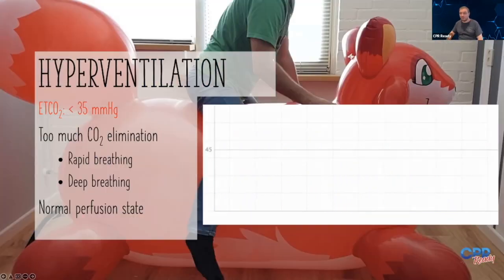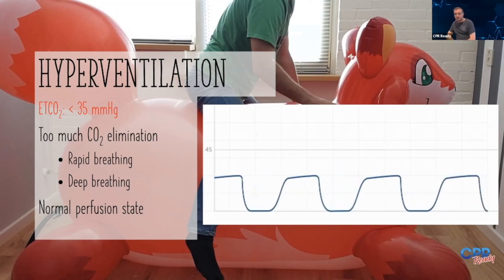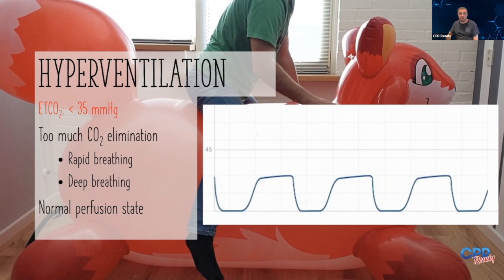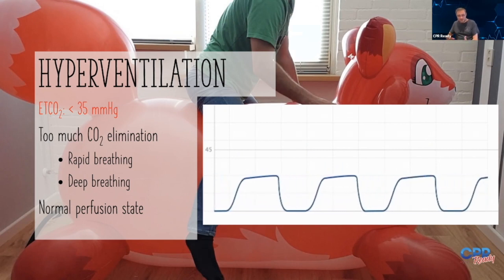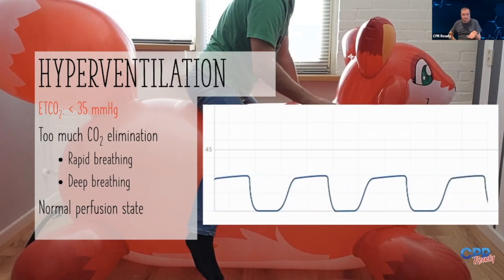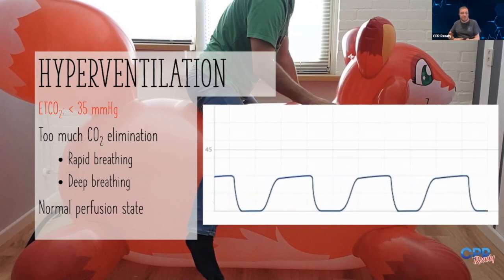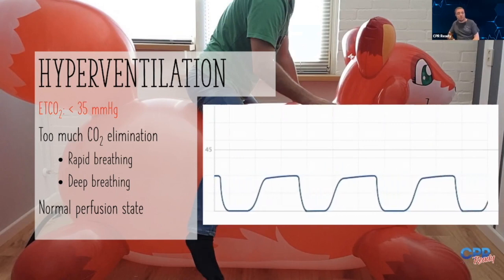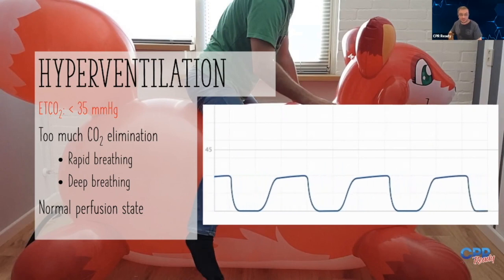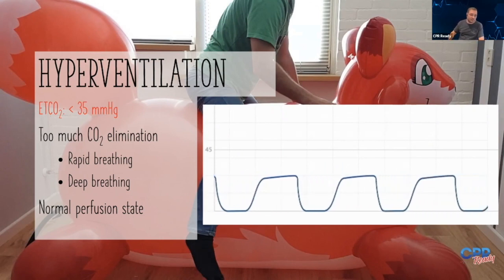Hyperventilation is the opposite end of the spectrum, right? This is caused by either too rapid of a breath rate or by deep breathing, which means larger tidal volumes. So think about if moving less air lets CO2 build up in the lungs, which will raise that number, then moving too much air gets rid of the CO2 too quickly, and that number gets low. So hyperventilation is going to show up as a low end-tidal CO2, or a number that's less than 35.